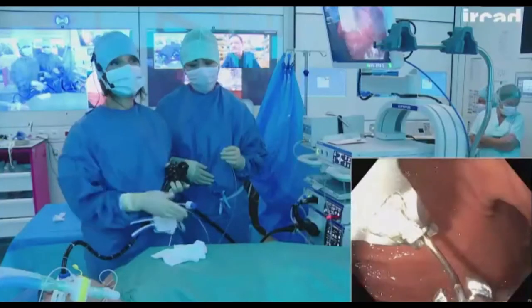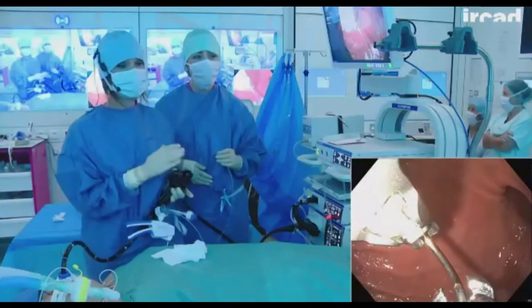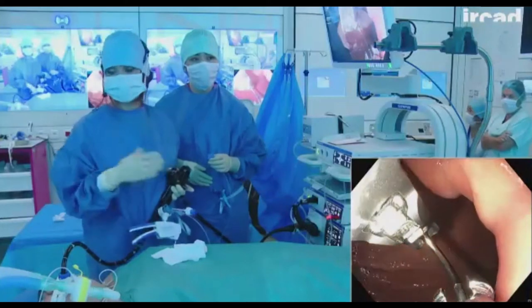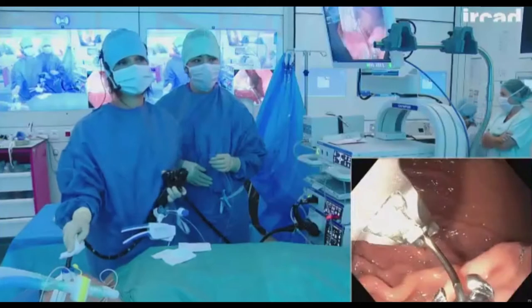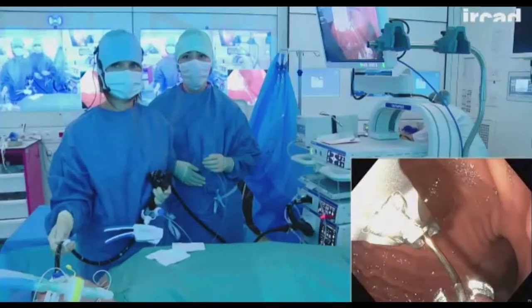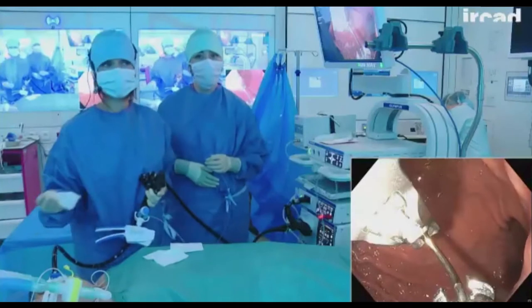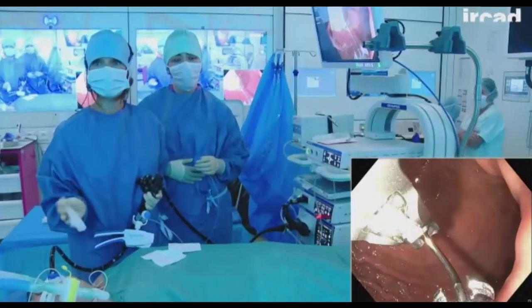Yeah, of course, that's a very good question. When I see a patient here, since I'm a surgeon, so I also do bariatric surgery, I always tell the patients that they have a lot of options. They can have a bypass, a sleeve gastrectomy, or an endoscopic procedure. This patient did not want to have surgery. She'd rather have an endoscopic procedure first, and then if she's fine with it and we have a good weight loss and good impact on her comorbid condition, we will stay there.